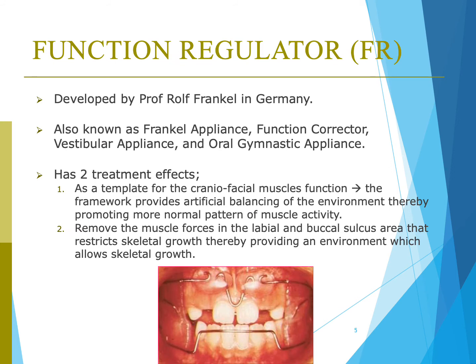Function regulator was developed by Professor Rolf Frankel in Germany. This appliance is also called Frankel appliance, function regulator, function corrector, vestibular appliance, and oral gymnastic appliance.